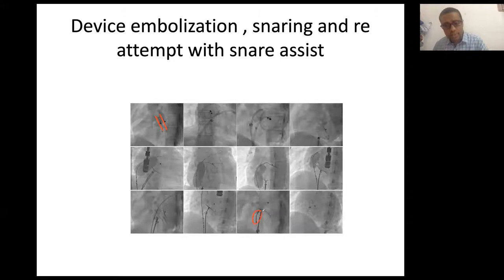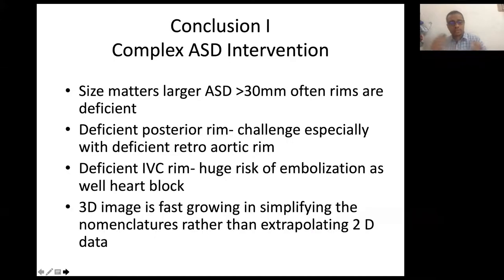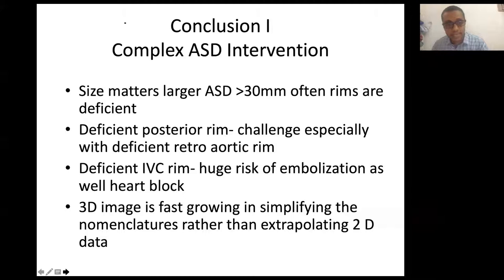In a case of device embolization, a snare-assisted technique can be used — after unscrewing, the snare holds the device and then is slowly released. We call this snare-assisted technique, which we use in particularly delicate cases as an extra added step.